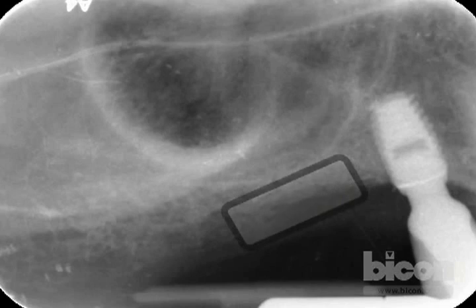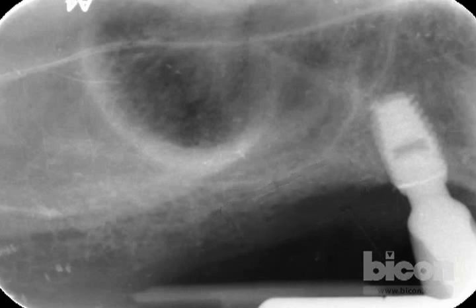and open a window at the crest, not on the side, but right here, elevate the floor of the sinus, with it the sinus mucosa, place a graft and implants at the same time. The design of the flap and design of the window will have to obey the actual anatomy and morphology of the soft tissues and of the bone.